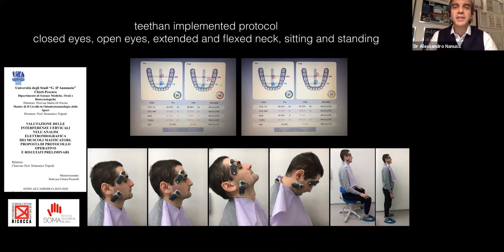It is not good, 68% of symmetry, with torsion to the right side, with the POC masseter, or with overload on the left side of the arch on the teeth of the patient, and overload on the anterior side of the arch. So I control if intercuspation is correct. It is not correct. Perfect. So I try to correct occlusion with my mouth guard. So my mouth guard is improved.